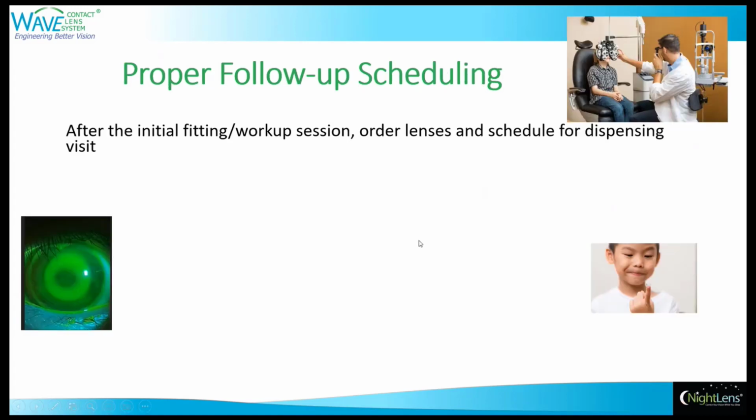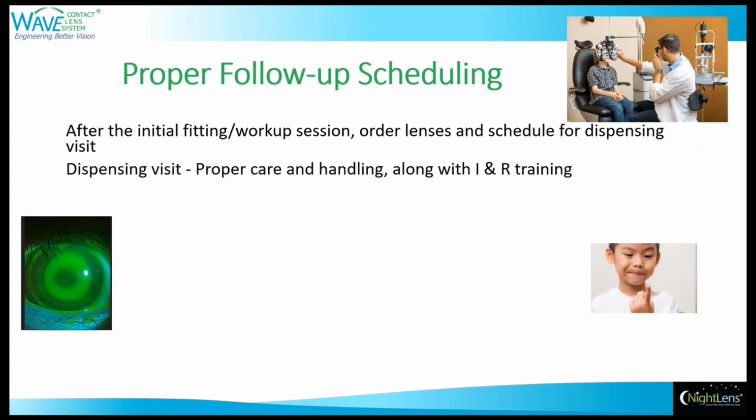All right, let's talk about the follow-up schedule. After your initial fitting or workup session, the lenses are ordered and you schedule the patient for dispensing. At the dispensing visit, of course, your staff member will go through proper care and handling, along with insertion and removal training. Now, kids are sometimes easy, sometimes difficult with the INR training. You just have to continually work with them, but eventually, at some point, they will do well.